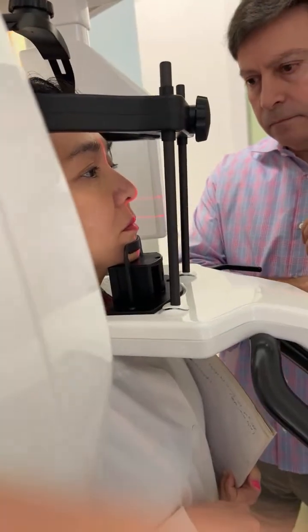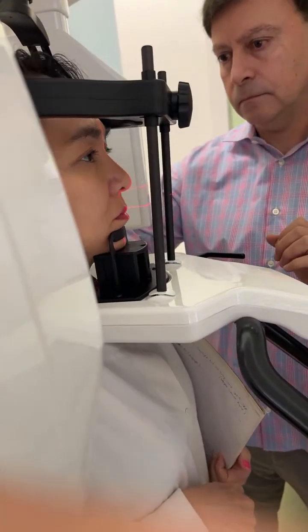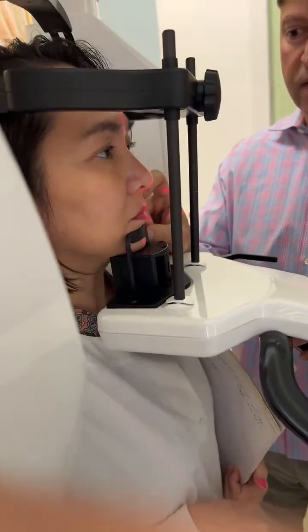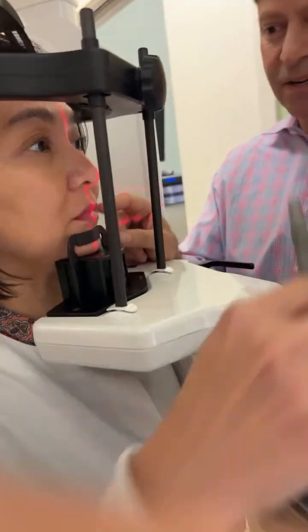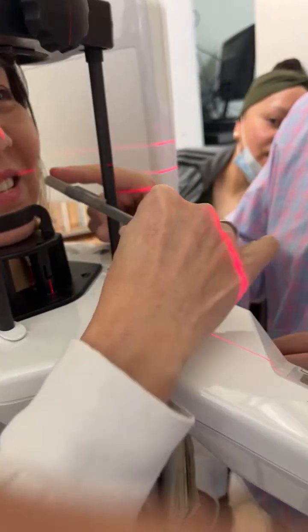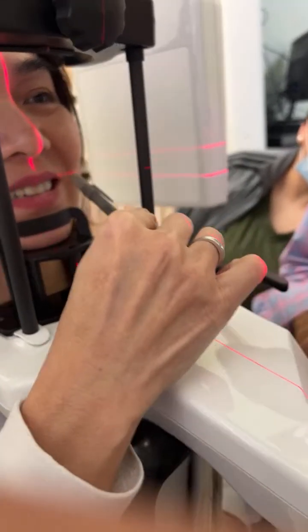Okay. That's still taking the X-ray for the lower. So you're under the inferior border and you have enough height. Smile. Show me your teeth. Look at you guys. Show me your teeth. Smile. See, we have the crowns of the opposing arch. But the lower, not. See that?